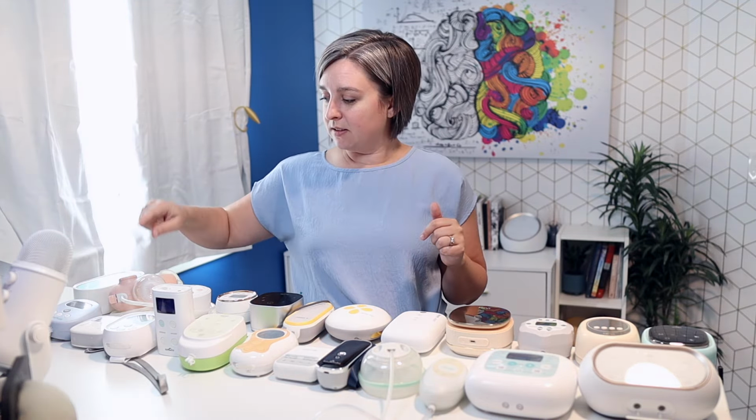So what else? Oh, the Genie Advanced. This one has 3 different cycle speeds for you to choose from, which is a great feature in my opinion. So while you can't specifically choose the number of cycles you want to do, you have slow, faster, and fastest, kind of give you a range. Again, it's still tied to the vacuum, but it will give you a range of speeds to choose from. That's a pretty unique feature on that one.